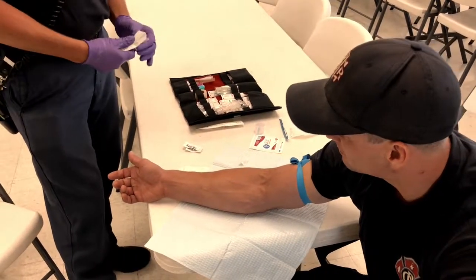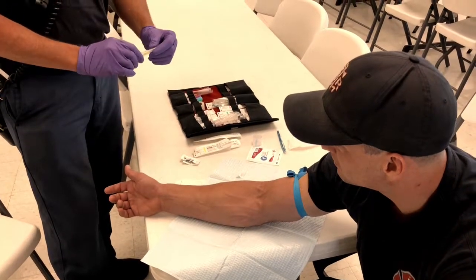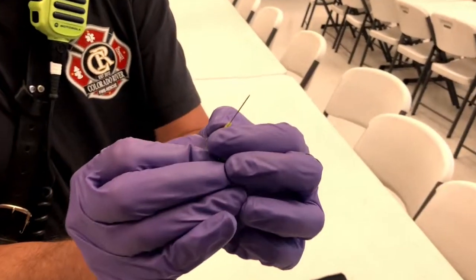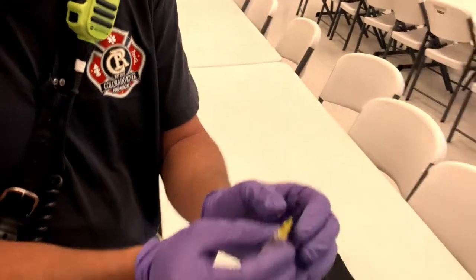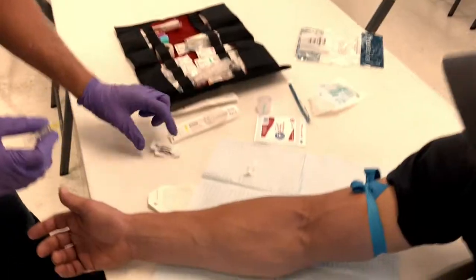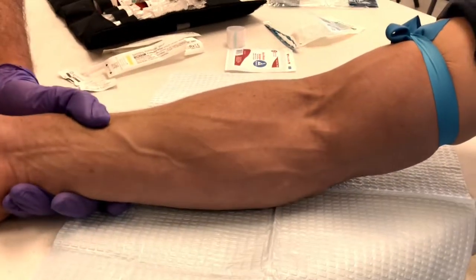I'll open my catheter. I'll inspect my catheter, make sure it's good. I've identified it's good. There's no shear. The bevel looks good. And the actual catheter is loose on the needle. Still have good visualization of the IV site.